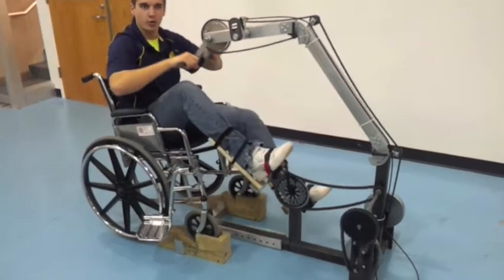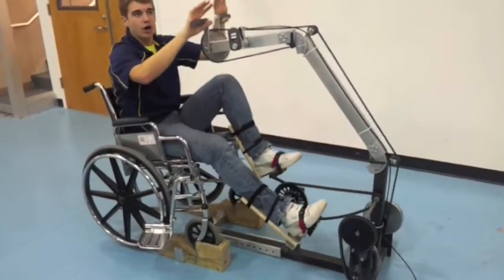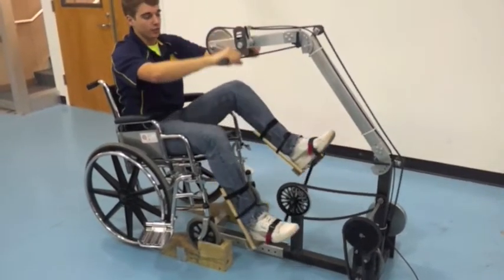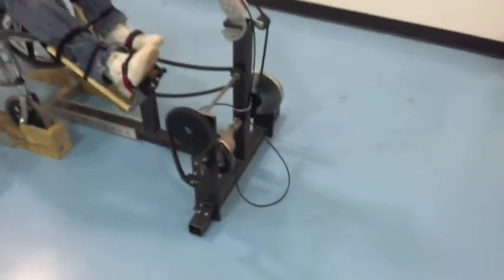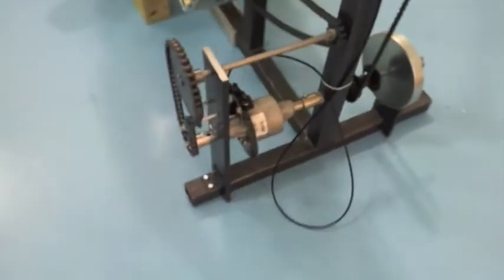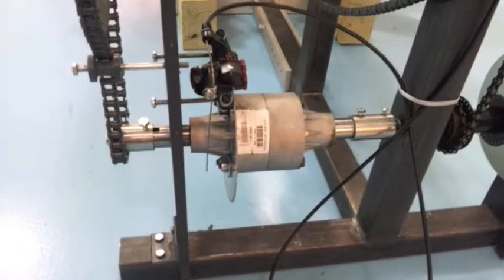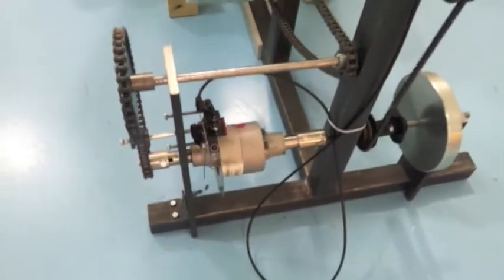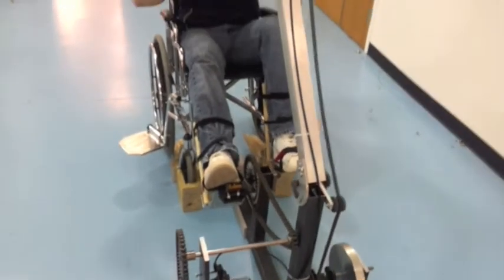If you have been working out for quite some time and your legs are getting kind of tired, what our bicycle does — and it is really innovative, nothing else on the market does this — we incorporate a differential with a disc brake. As you unlock the disc brake, it allows you to decouple the hand and the leg movement. As you can see, I am continuing to get my good arms workout, but my legs are just staying there.